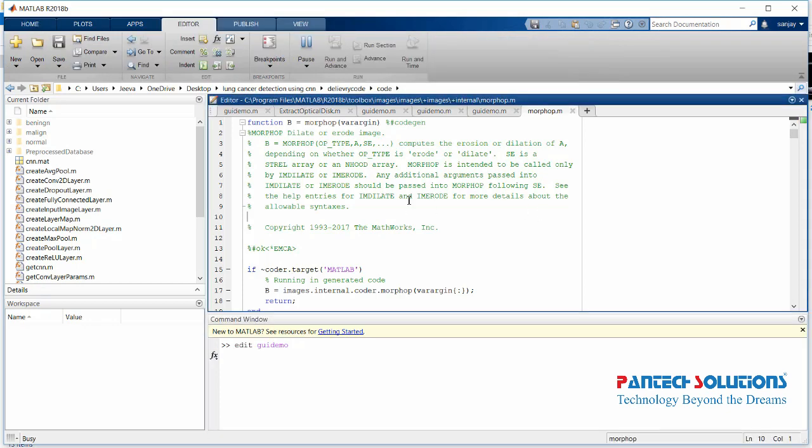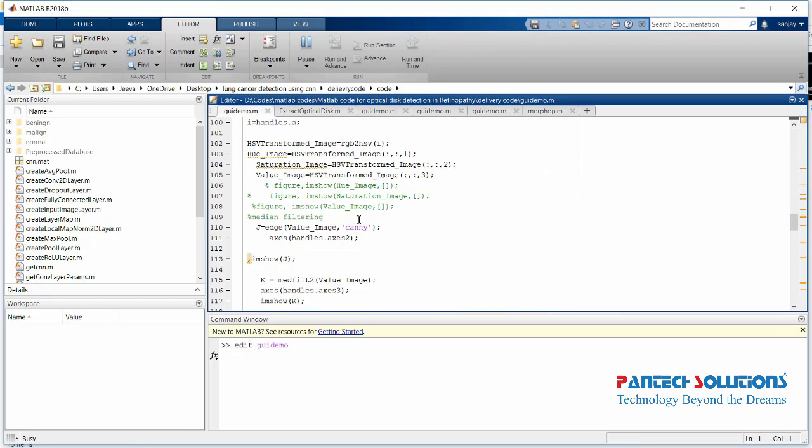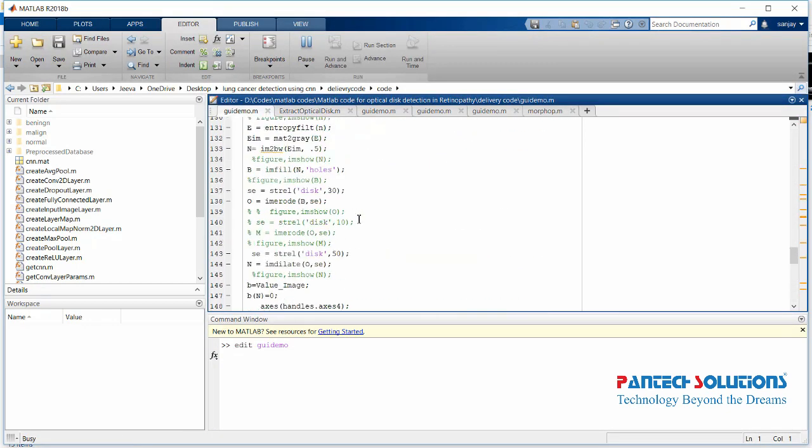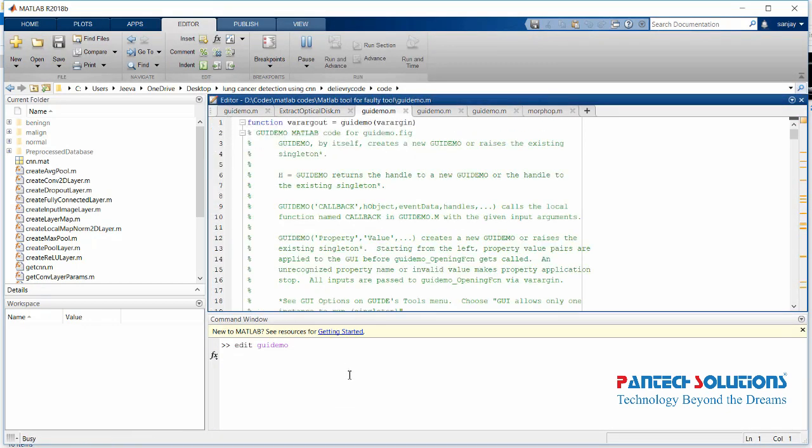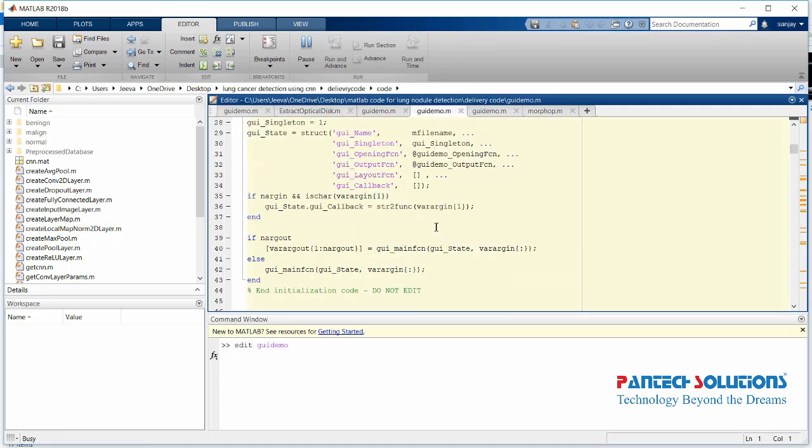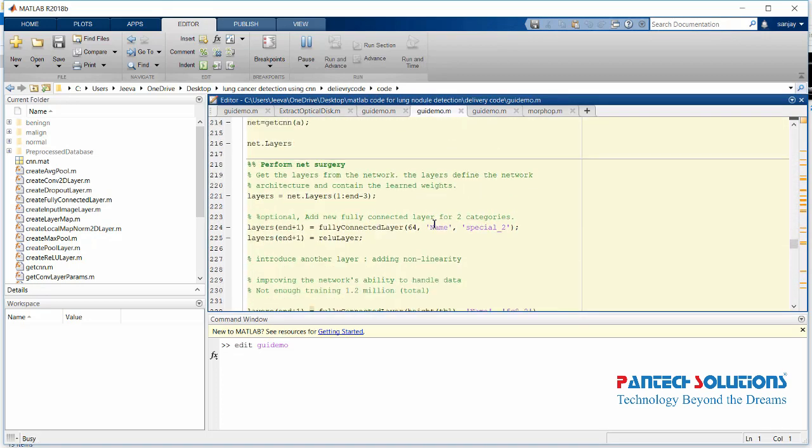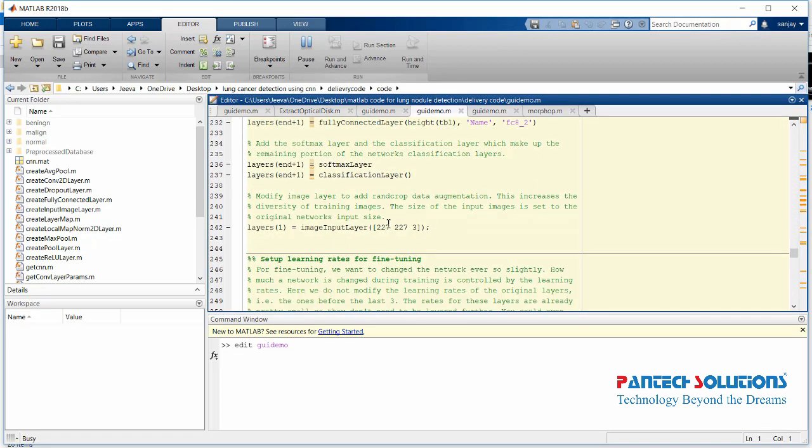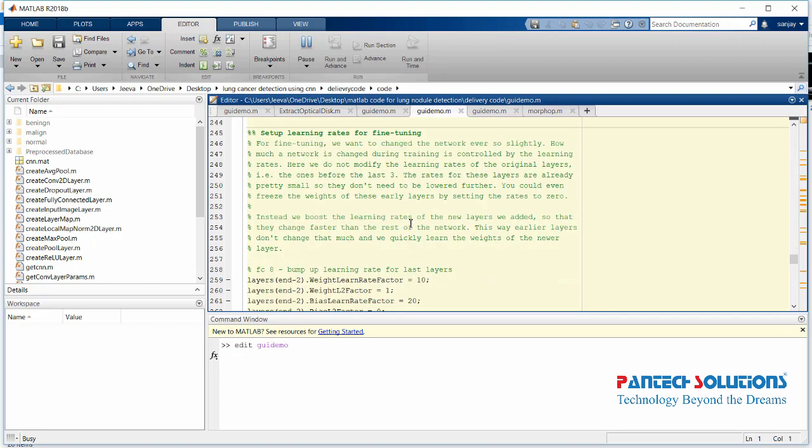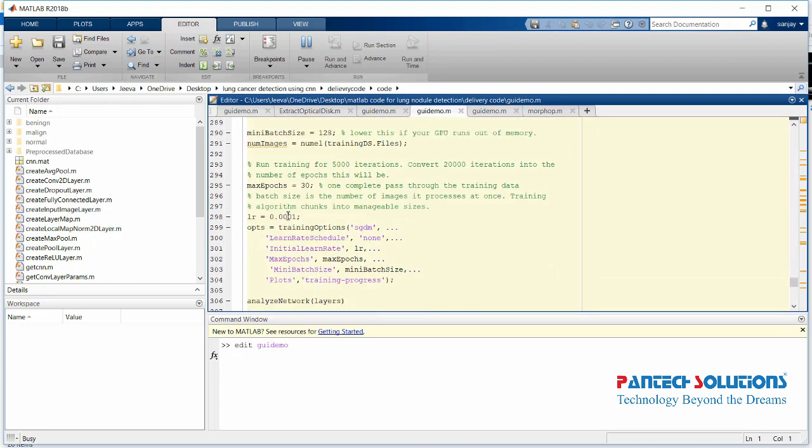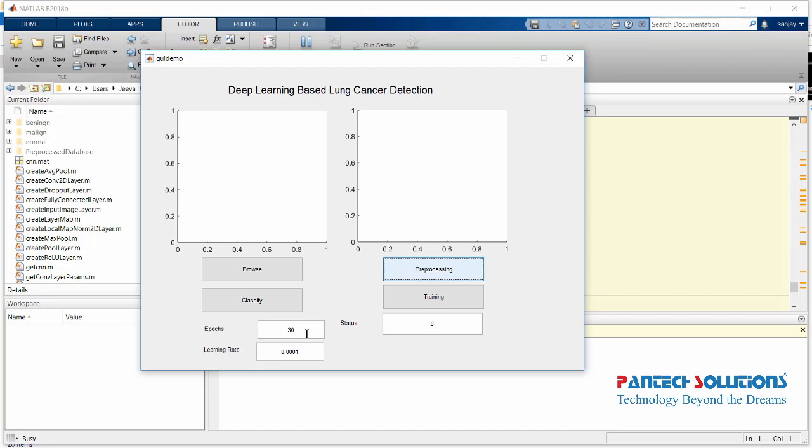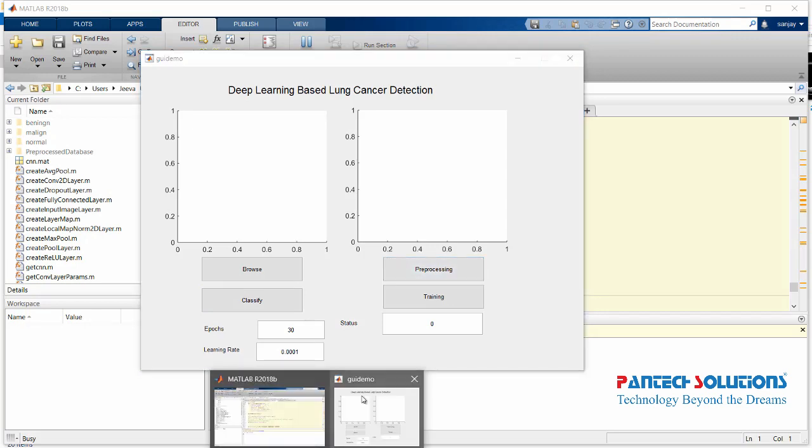So the first process is pre-processing the database. This process removes the text and other content in the images. When you click pre-processing, the MATLAB code performs the algorithm by reading the images from the database.